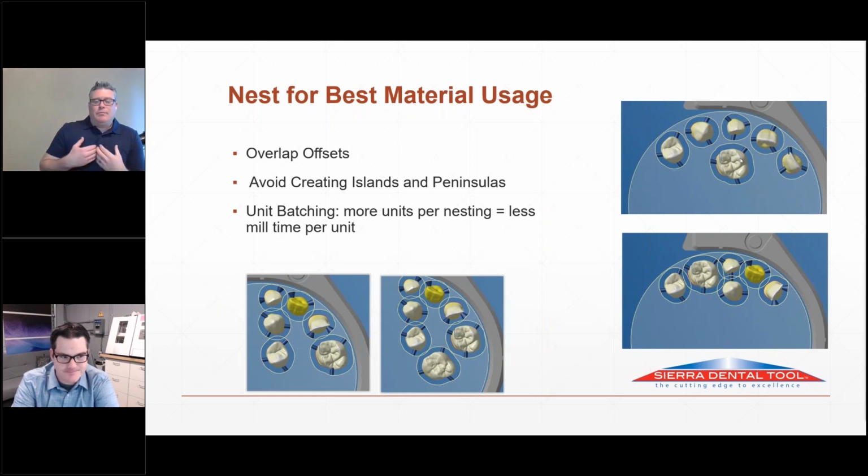That'd be like you hiring me to come to your lab to evaluate your stuff, and I go in and grab a cup of coffee and sit down for 2 hours. I'm not doing anything. So the big thing is go in, throw 4, 5, 6 units in there, start the mill. Greg will reiterate this: if it's not running, it's not making you money. You're just paying it to sit there and do nothing. I spent a lot of time managing a milling center, and if your investment machine isn't running, it's not making you anything. If it's not producing, you're losing money.